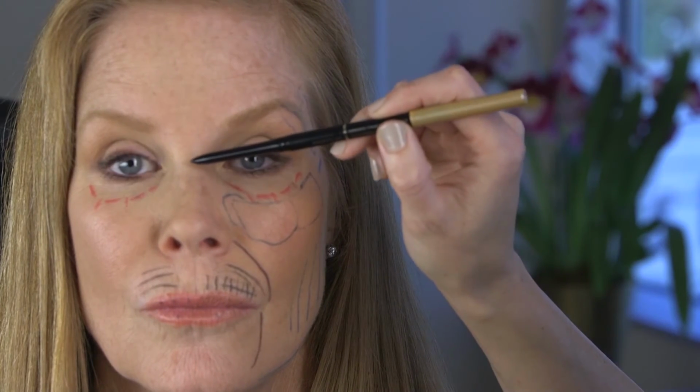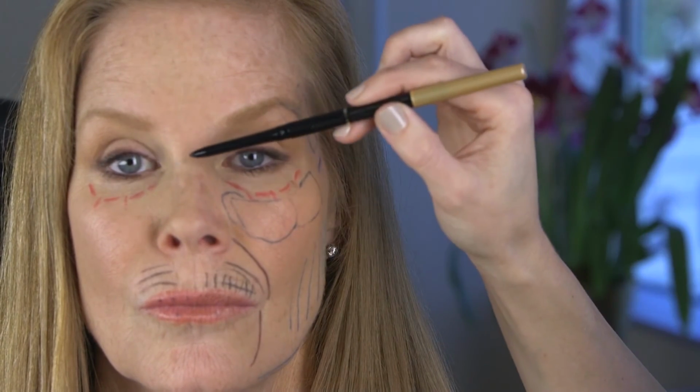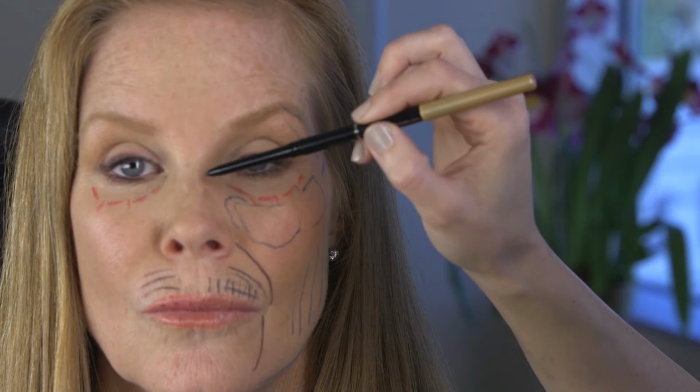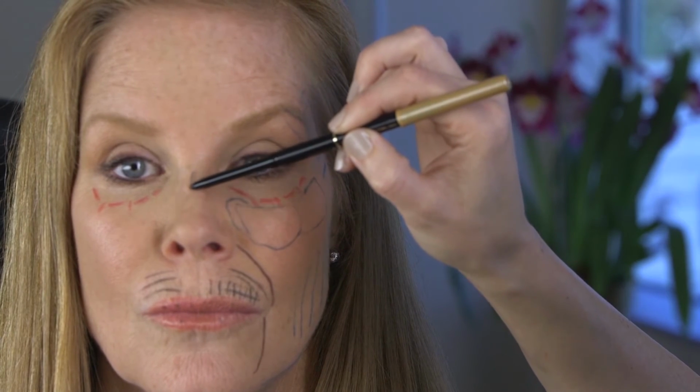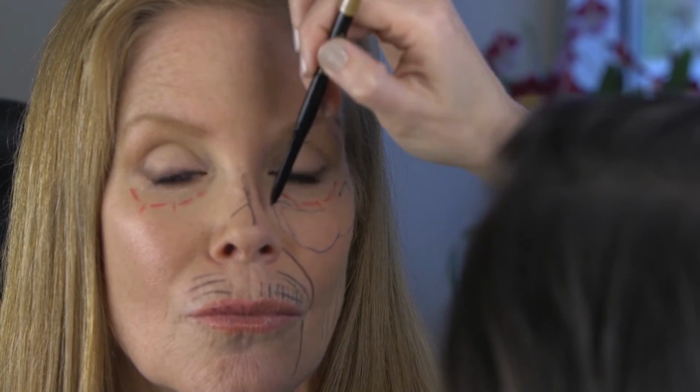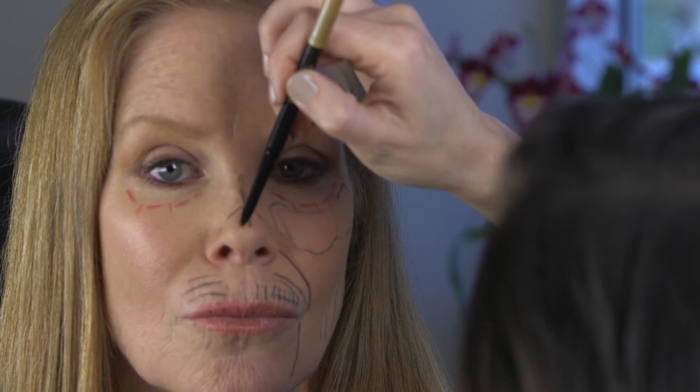You can also use hyaluronic acid-based fillers to help with the contours of the nose. Some people have little dips and depressions or little bumps or natural asymmetries in their nose. So you can actually use soft tissue fillers in the nose to help with different angles, just to help soften the nose. She doesn't need anything like that.